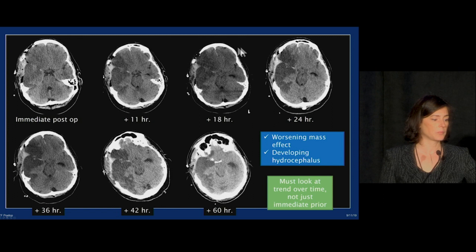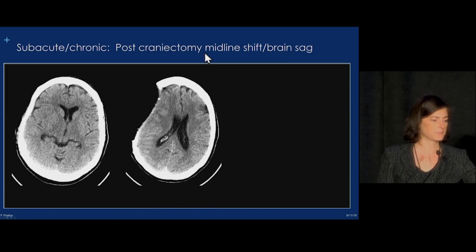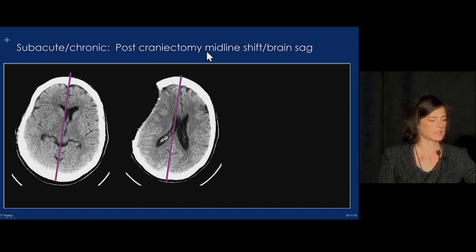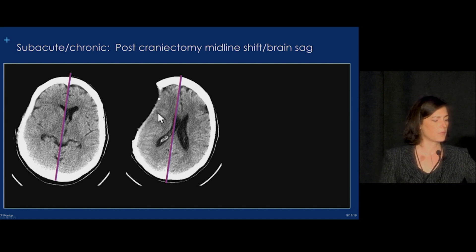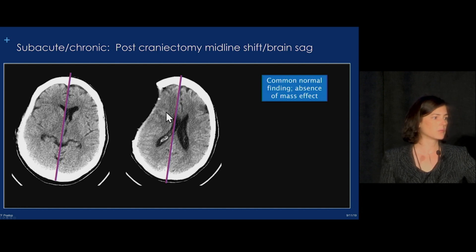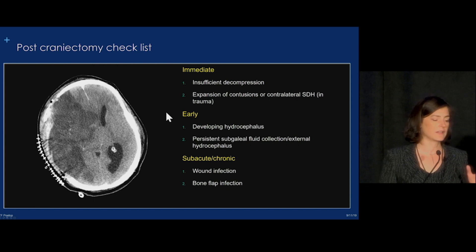Despite the very good decompression, this patient continued to have mass effect and the family opted for no further intervention. In a different case of decompressive craniectomy, we see midline shift going in the wrong direction — right to left shift after a right decompressive craniectomy. In this case, the brain is quite slack in neurosurgical terms, with no mass effect. This is a common normal finding of brain sag after decompressive hemicraniectomy. As long as there's no mass effect, it's not something to worry about.